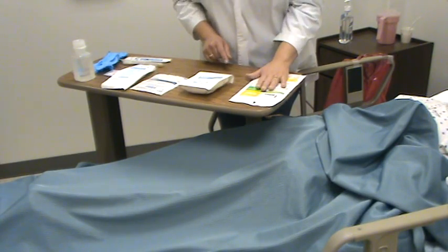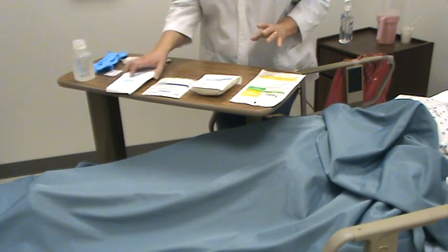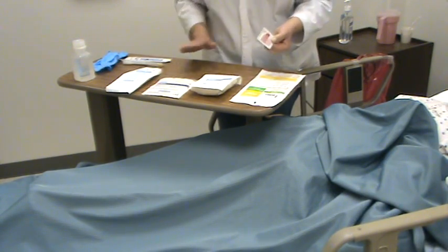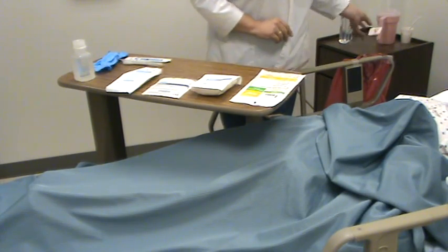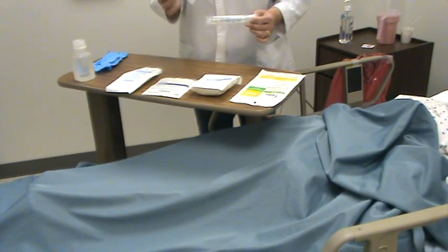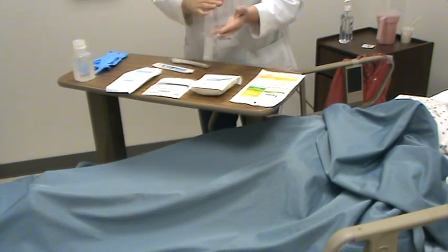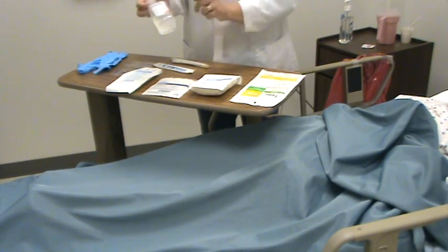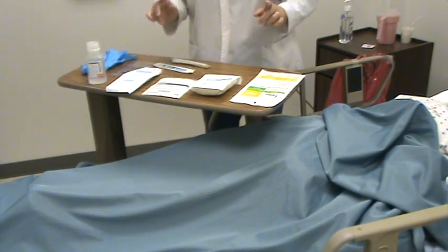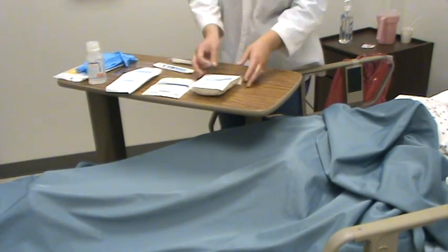I've gathered my supplies. I've got my sterile gloves, I've got fluffs, I've got 4x4s, I've got an ABD, I have an alcohol wipe, and I'm just going to say that I've cleaned my table already and it is dry. I've got my culturettes, I've got cotton tip applicators, you need a measuring guide, normal saline because that's what my physician ordered, and clean gloves. So the first thing I want to do is open up my supplies.